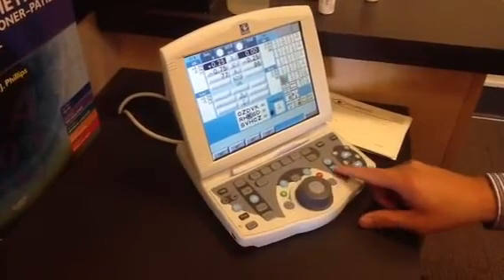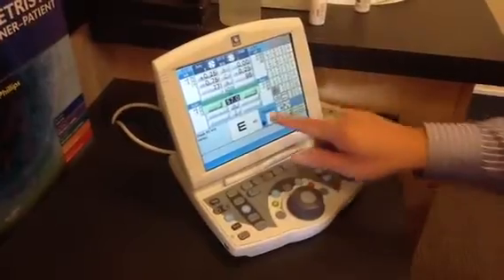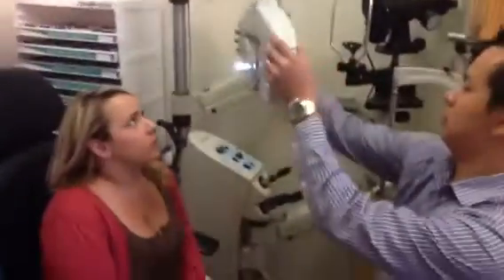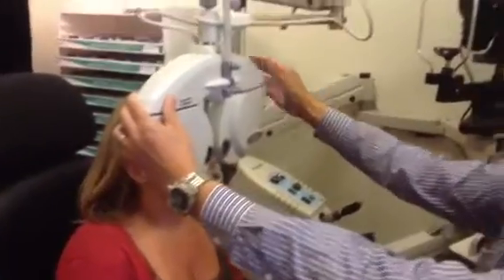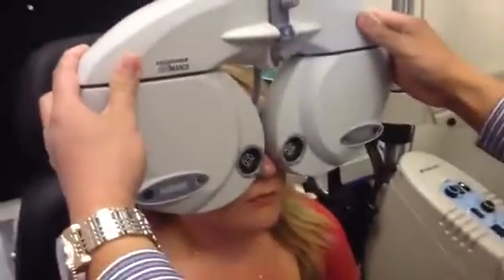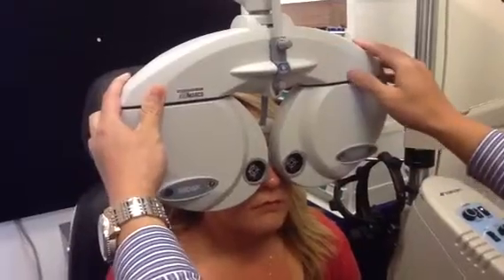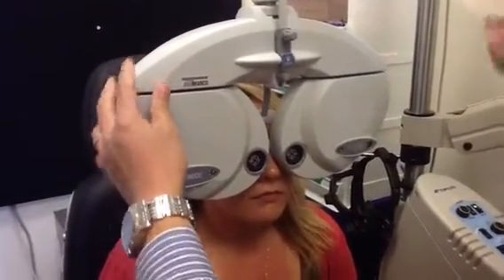When I start a patient, I usually press forward until I see the PD. Once the PD is on there, line the patient up. On here there's a little blue light. When the blue light is on, that means the patient's forehead is not on there. Make sure the blue light is off while the patient is on there, and then you can line them up.